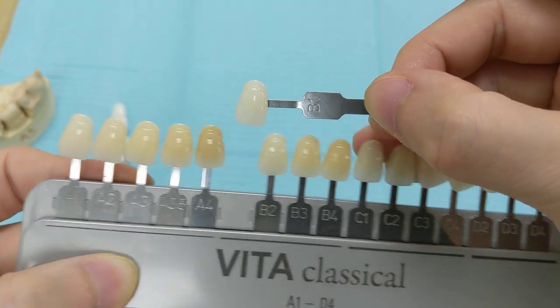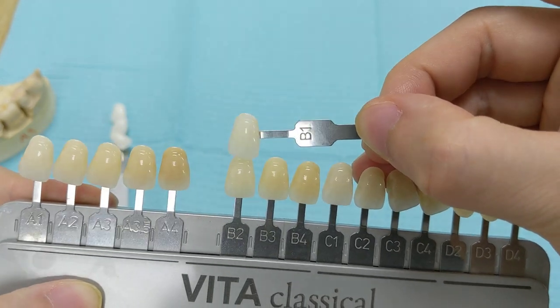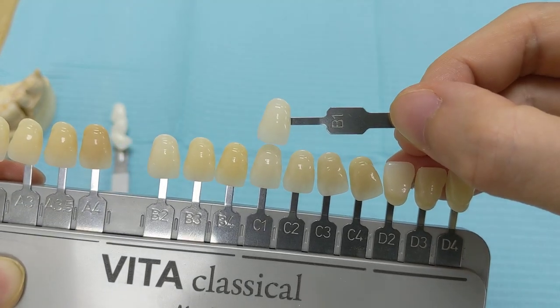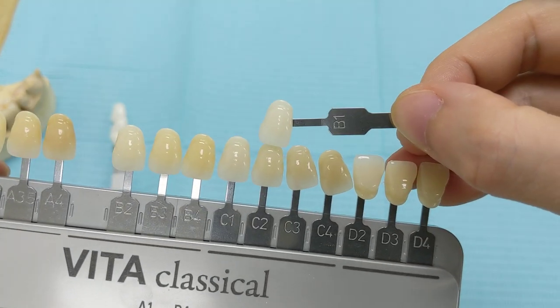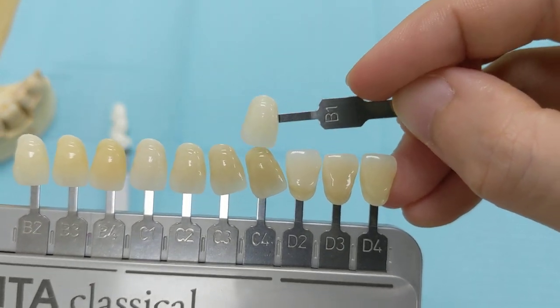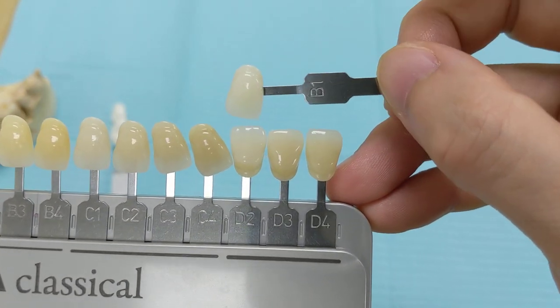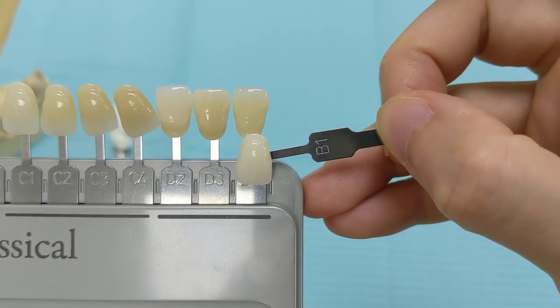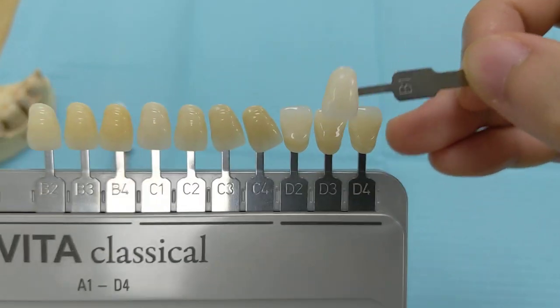That A4 is really really dark. B1 versus B2, B3, B4, B1 versus C1, C2, C3, C4 — that's really dark too. B1 versus D2, D3, and D4. And these fours are really really dark.